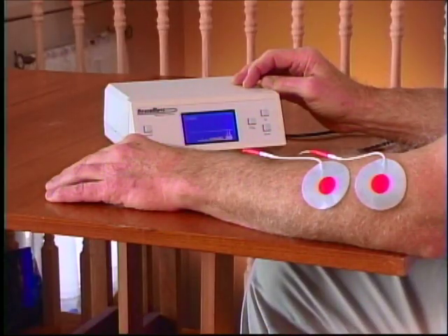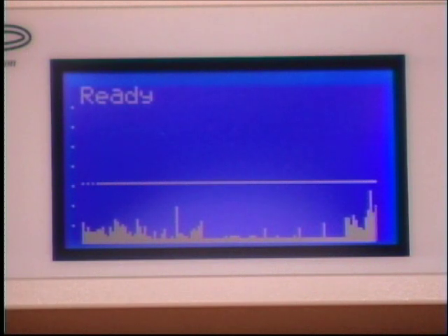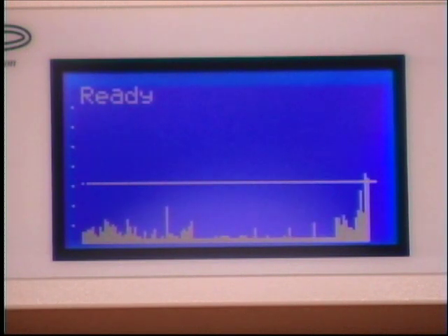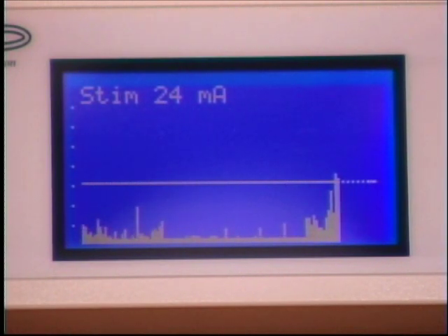Now think hard about moving the muscle group and imagine that it actually happens. As you do, the bars on the display screen will rise toward the threshold. The unit automatically adjusts your threshold to a level not too difficult to reach. When the vertical bars hit the threshold, the NeuroMove rewards your effort by contracting the muscle and giving you a warm vibration. When this happens, relax, let the bars go down, and the unit adjusts the threshold — then repeat the process.